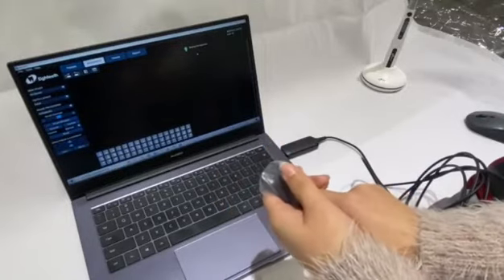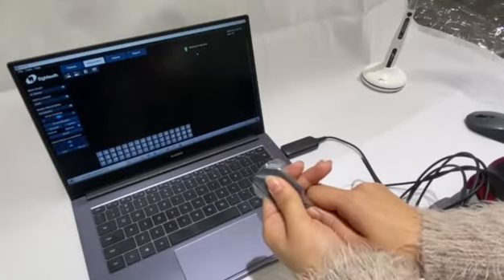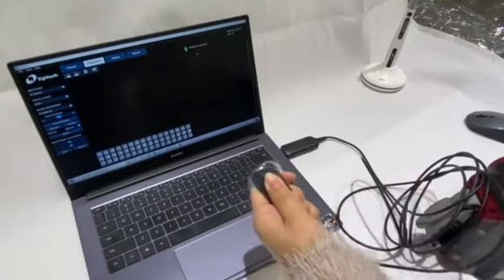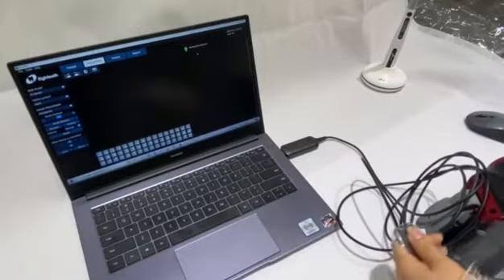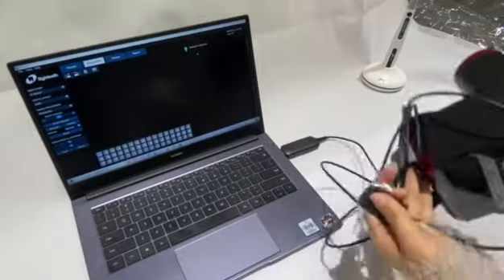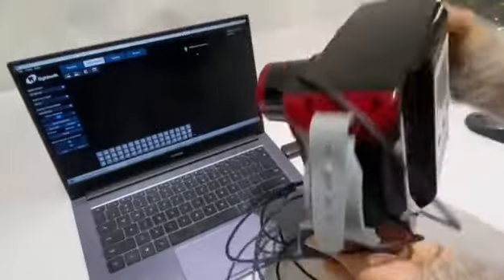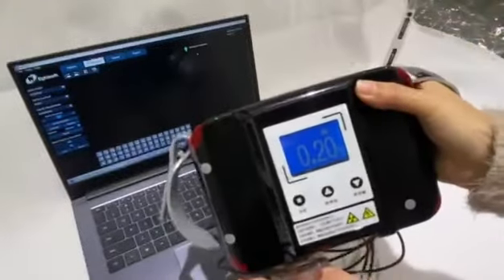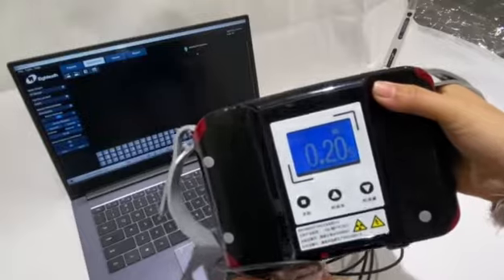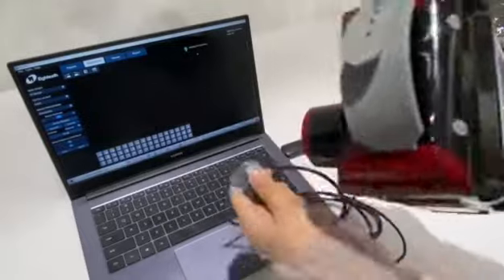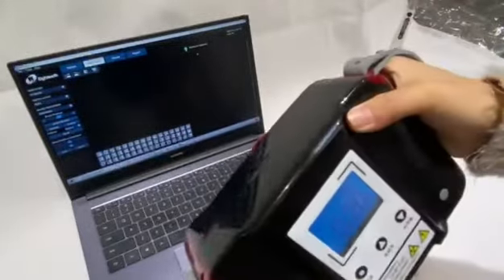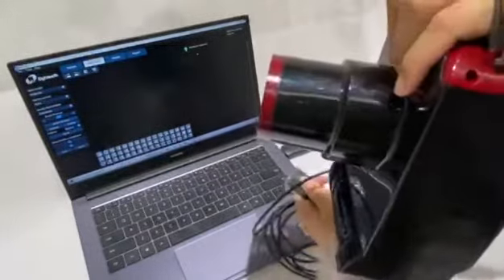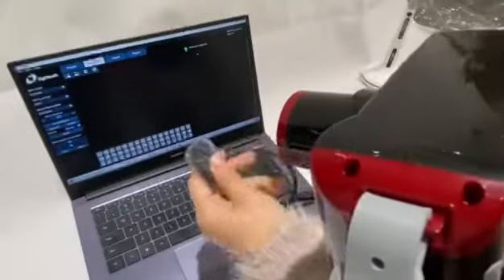We will use the x-ray machine. This is a portable x-ray machine. The exposure time is 0.2 seconds. Now we click here to exposure.